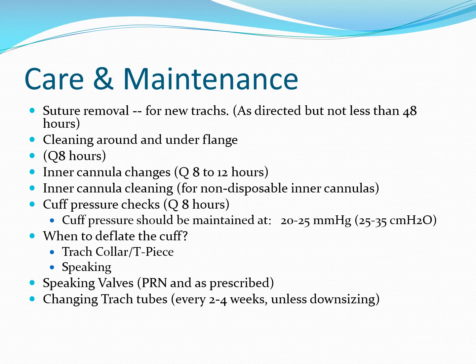When to deflate the cuff is really important to remember and to remind your staff: if the patient's spontaneously breathing, the cuff should generally be deflated. There are rare exceptions. At the acute care facility where I work, we have an active head and neck cancer program.